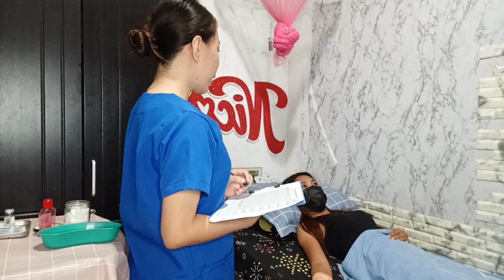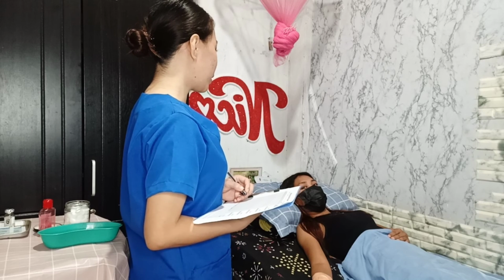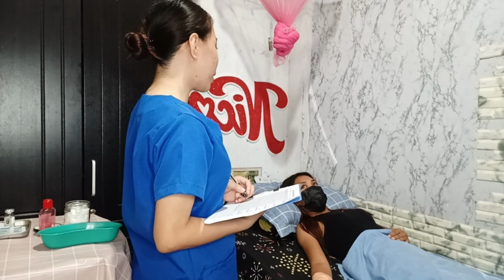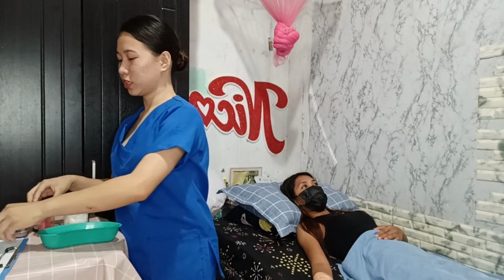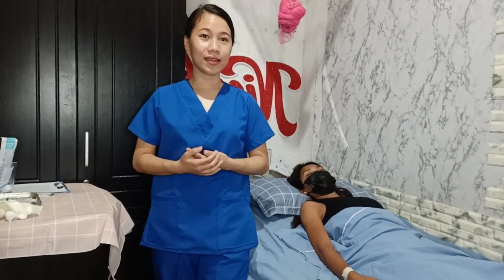Okay, ma'am, we are now done with your skin test, but we still have to wait a few minutes to have the result. And please do not massage the area where I did the injection, and do not remove or erase the mark. Is it okay with you, ma'am? Okay. Then perform hand hygiene. And that's the end of administering the intradermal injection.